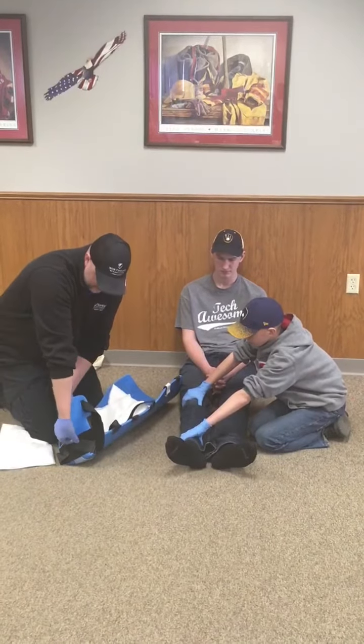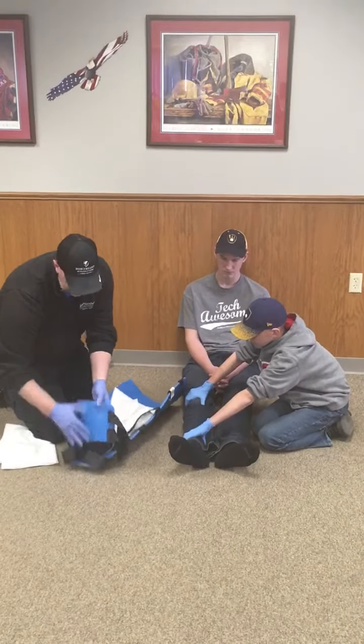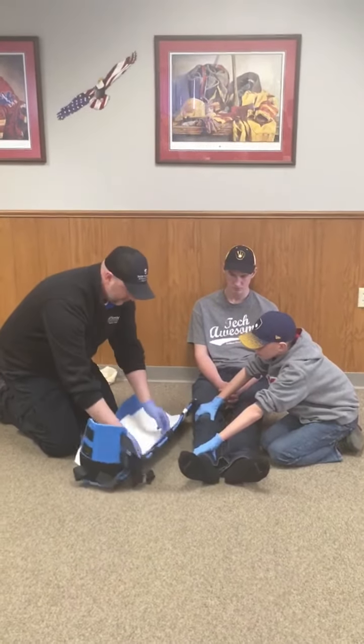I'm loosening the ankle stabilizing straps to open it up a little more, and I'm going to lay my trauma dressings on the inside of this splint.